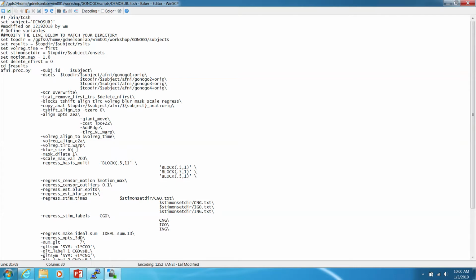Now, the thing about our neuroimaging data is, as Eric mentioned before, there's a lot of noise in the ratio between signal to noise. In order to see the true neural activity, you have to deal with a lot of factors about noise. One way we deal with that is by looking at specific events and having everything well synced in time.